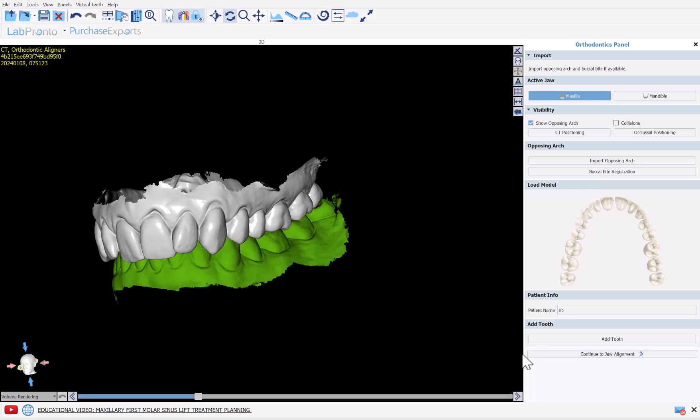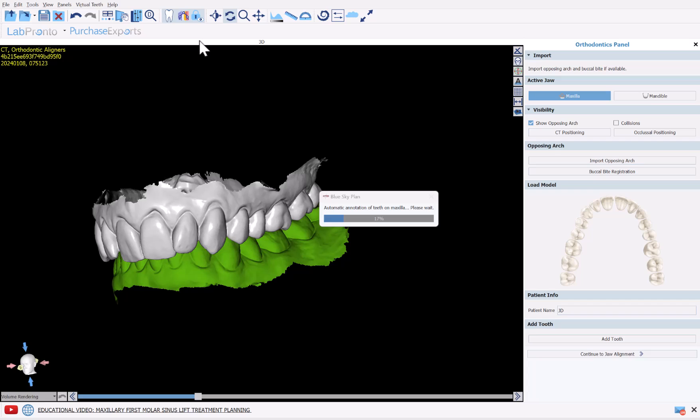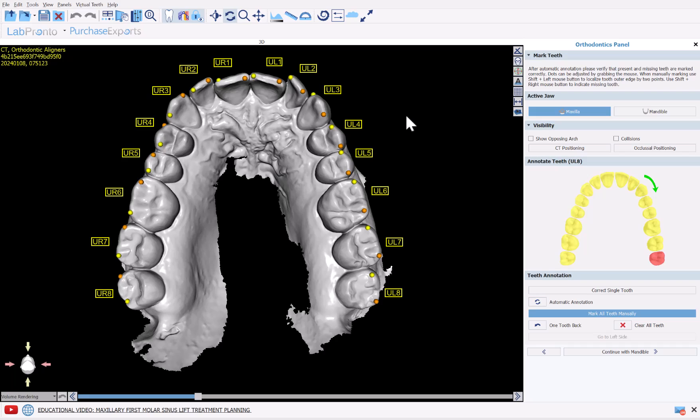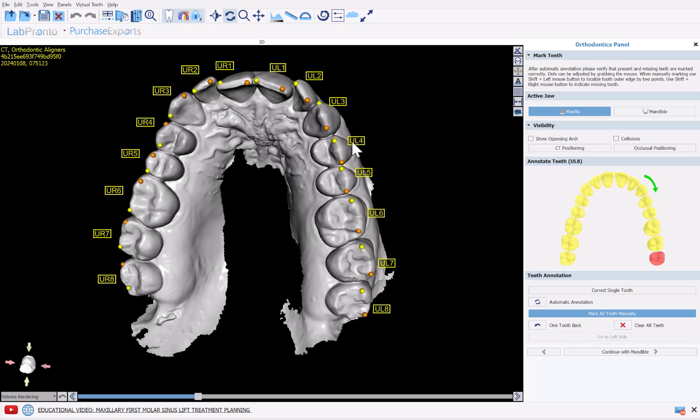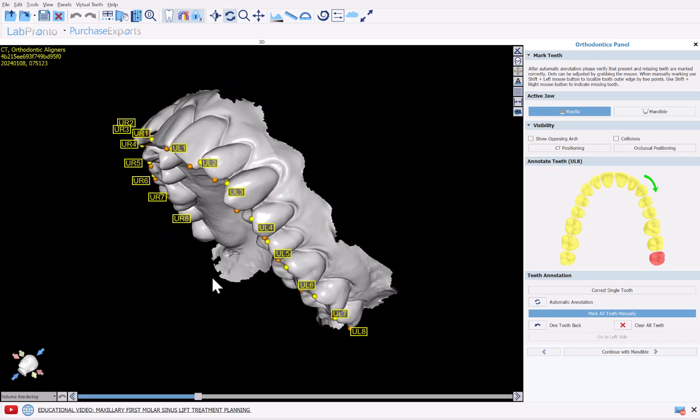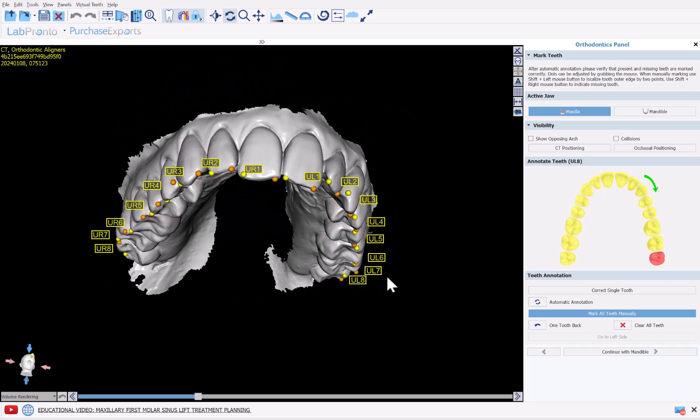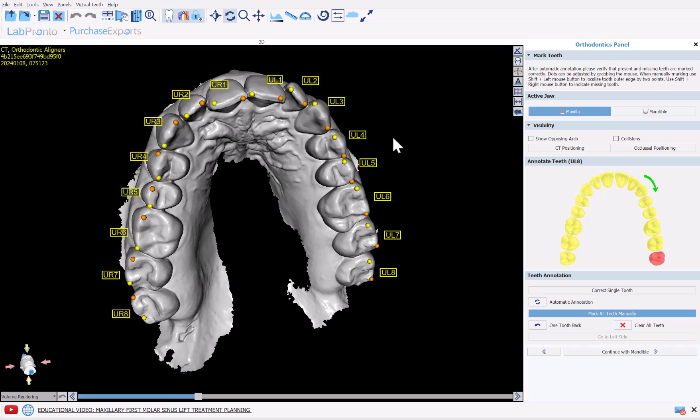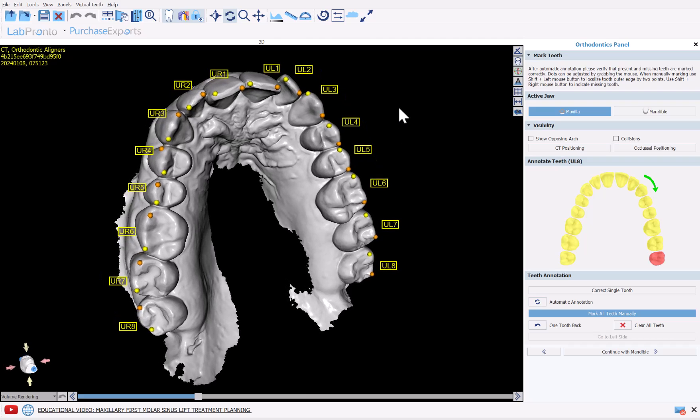So when relevant, use the Add Tooth option to add a missing tooth. And now I'm going to click Continue to Draw Alignment. The software is now automatically going to annotate and then it will segment the teeth. We can see that the software has now identified and annotated the teeth automatically.